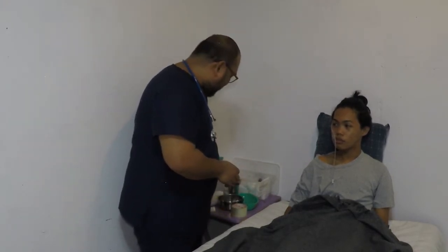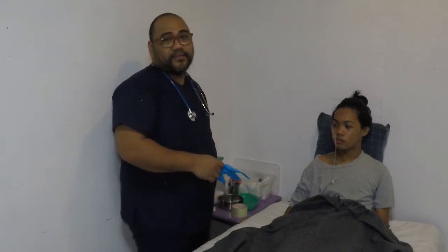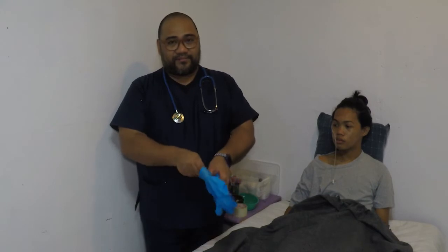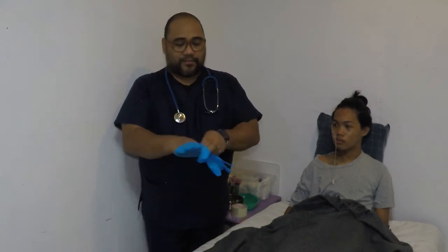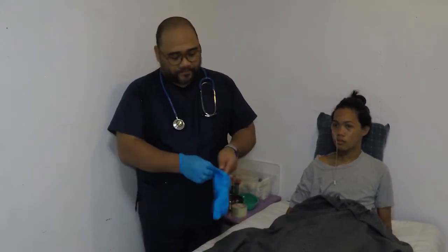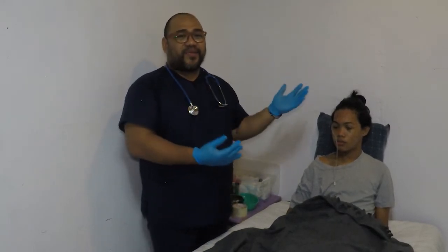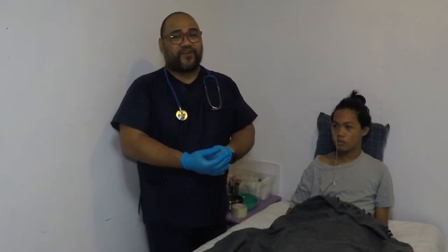We also have to perform hand hygiene and put on disposable gloves if applicable. We already positioned the client with the head of the bed elevated at least 30 to 45 degrees.